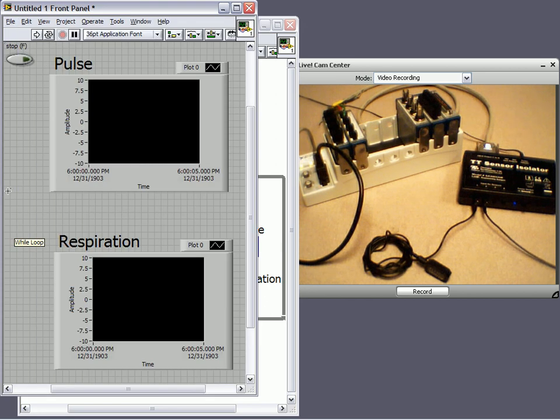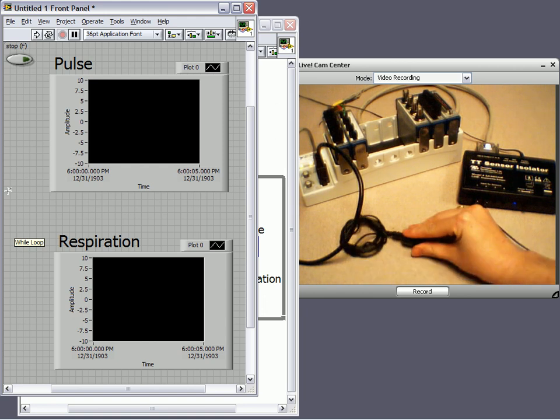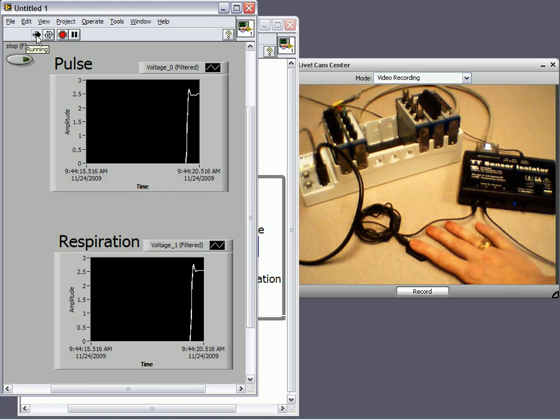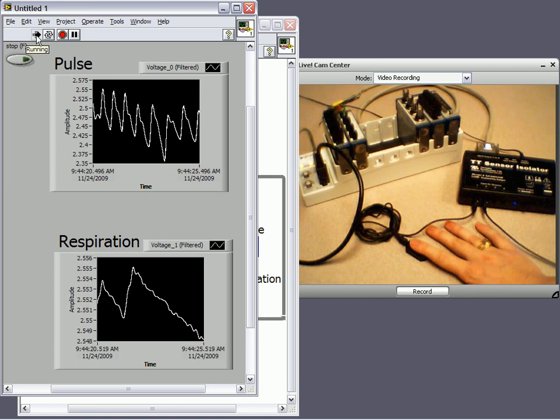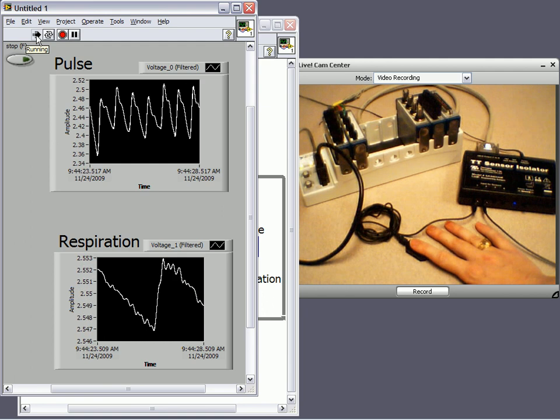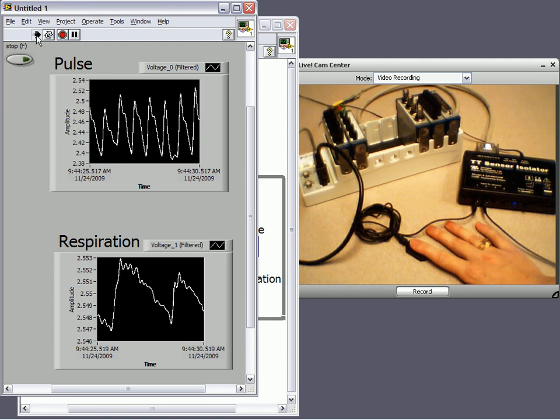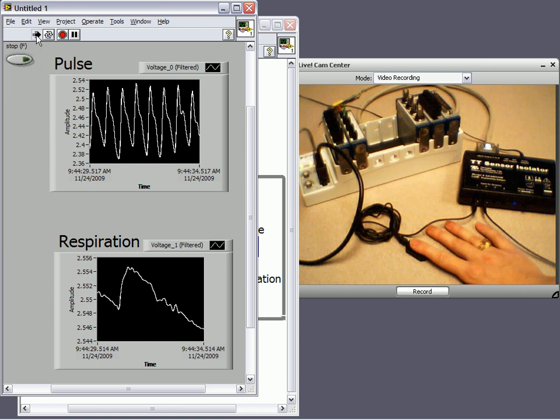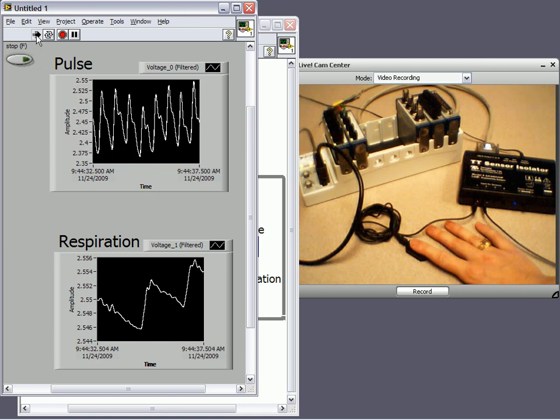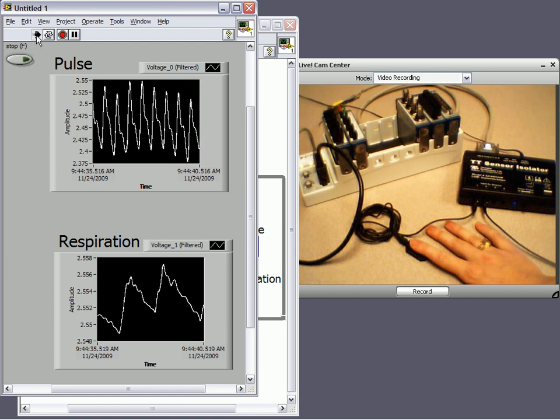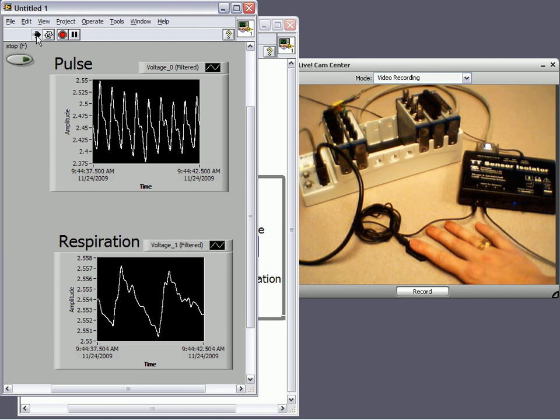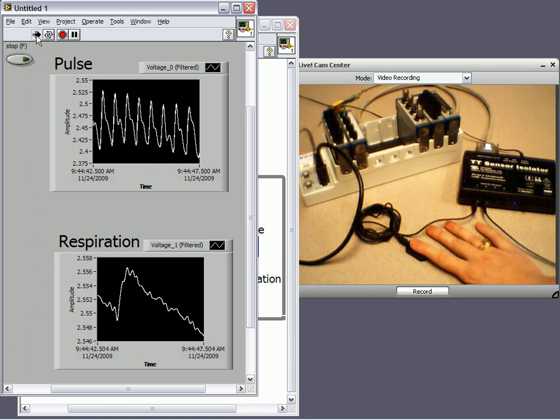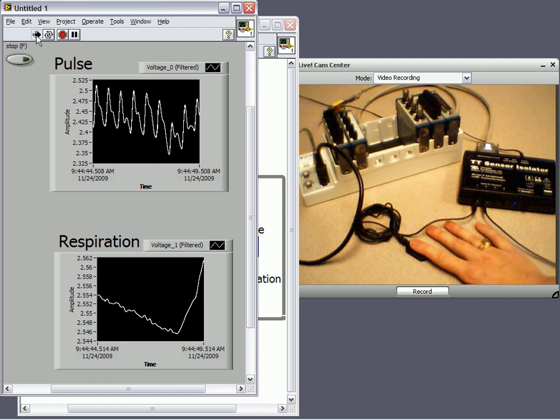So, let me come over here and place my finger on top of the LED and photodiode of the heart rate sensor and click run. And we should see our signal begin to vary. In the top, you can see that varying heart rate. I've left auto scale on so that we can zoom in and see. You'll notice there's about a 2.5 volt offset introduced by the isolation. And then the respiration rate, if on the bottom screen, I stop talking for a bit, we can see the respiration rate vary. So, this is how you acquire data from the NI biophysical measurement system.